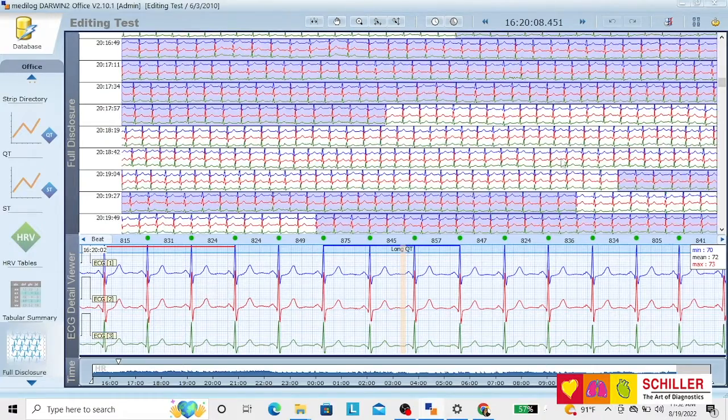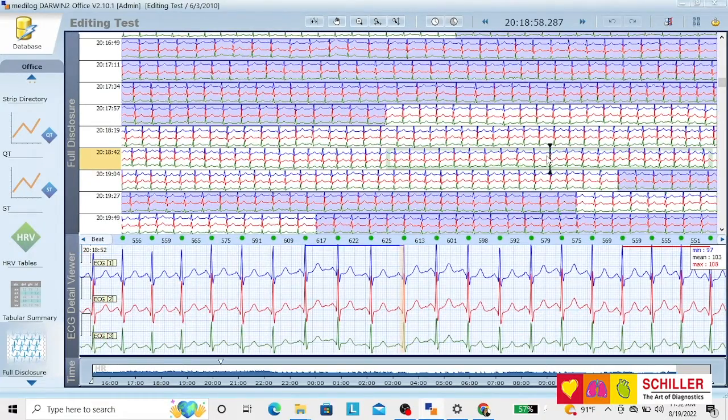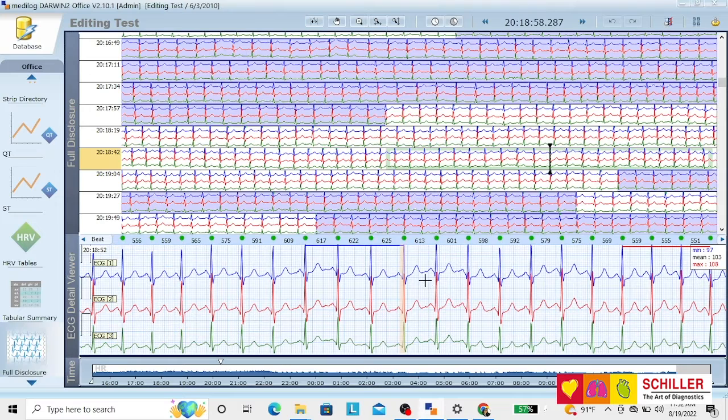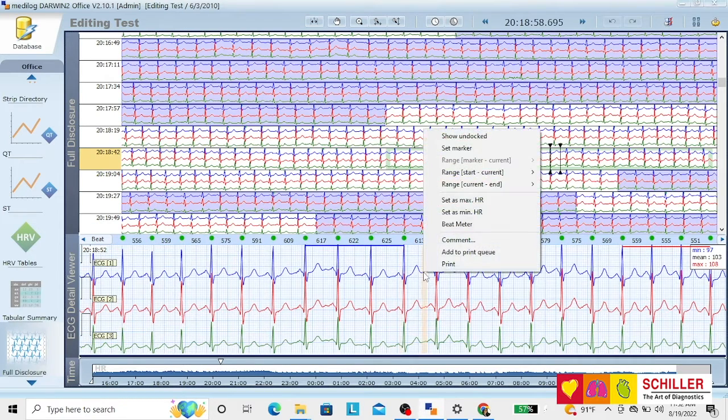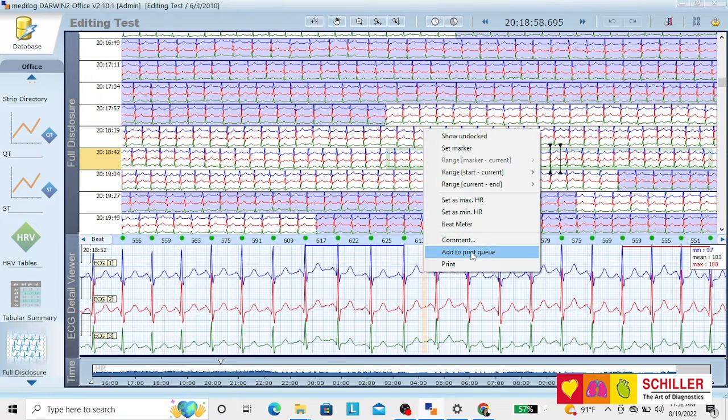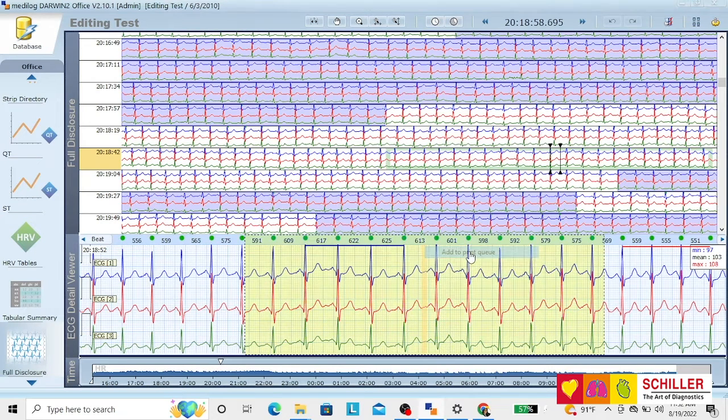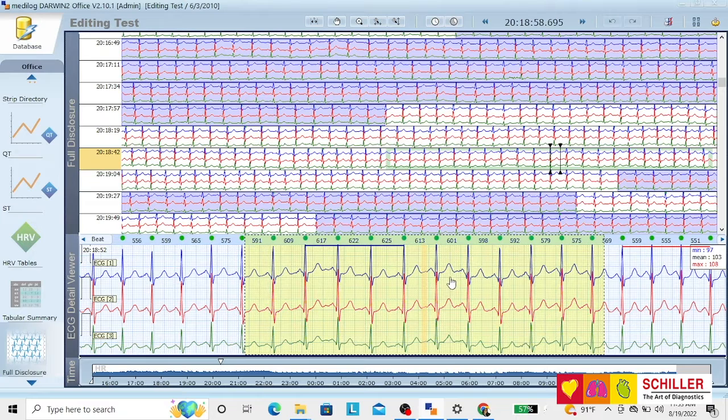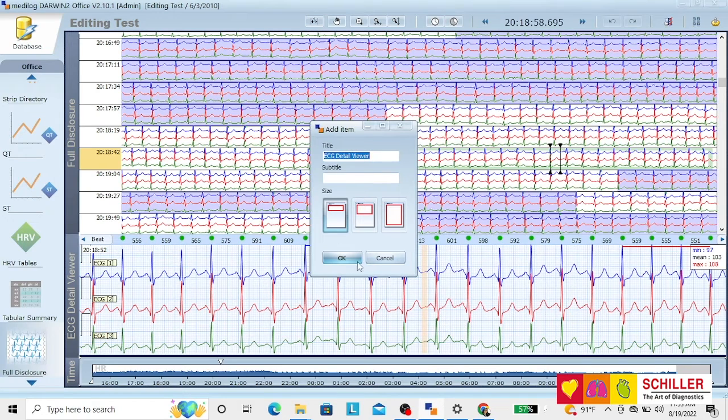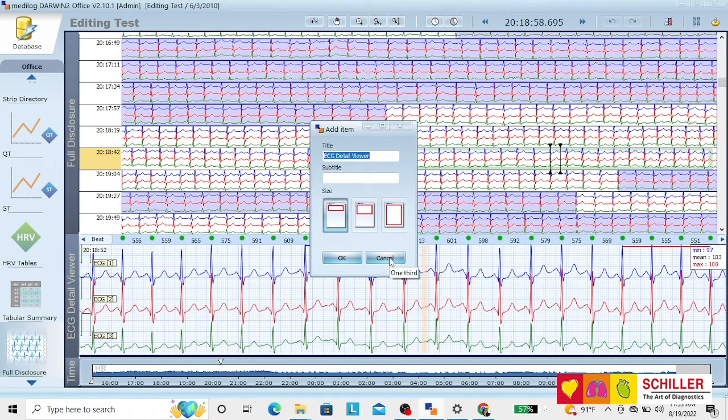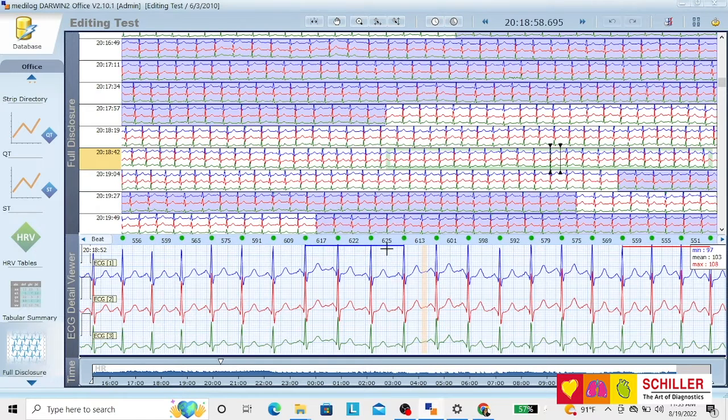You can select any part. If you want to print this as something interesting, just right click and go to add to print queue. And that moment, it sends it to the print queue directly. If you click on that, you can change the name, put anything that describes what you're looking at.